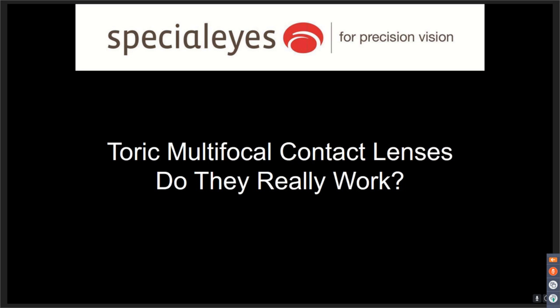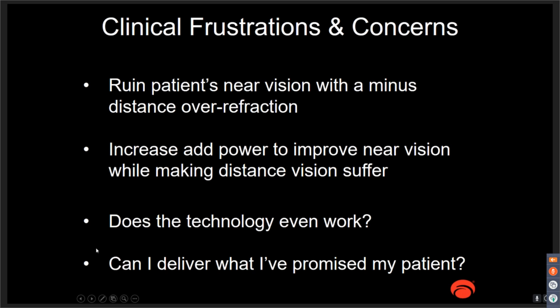Okay, I'd like to welcome everybody tonight, and I hope we can hold your interest for the next 45 minutes to an hour. Now, the topic is toric multifocal contact lenses, and do they really work? And let's see if I can get it to advance. There we go. What's the normal clinical frustration with it?